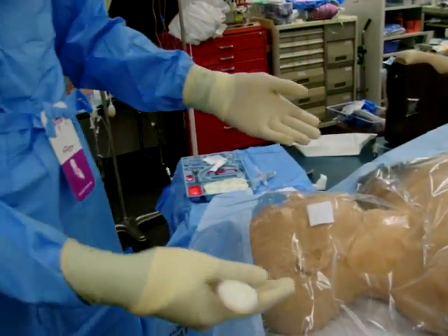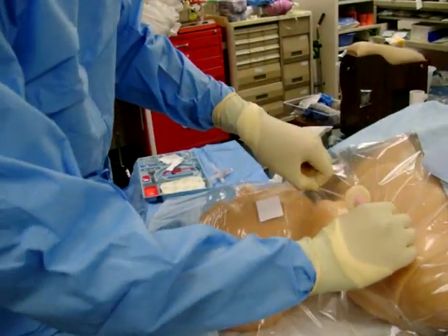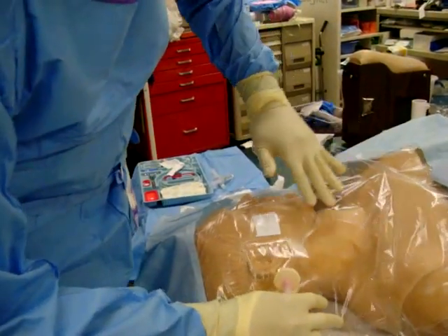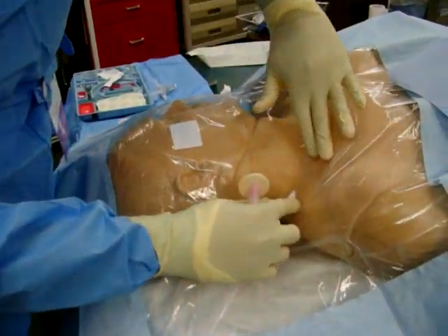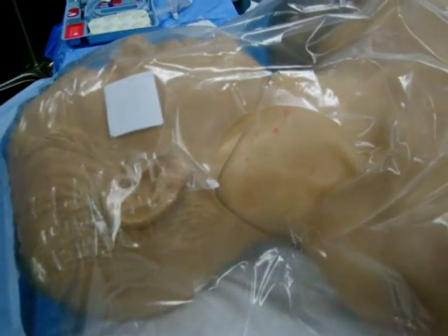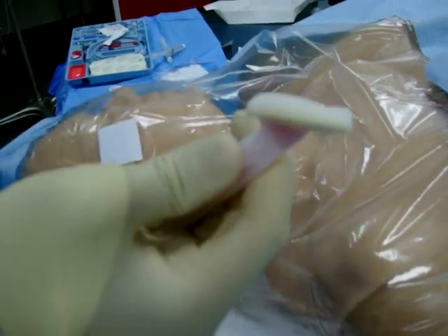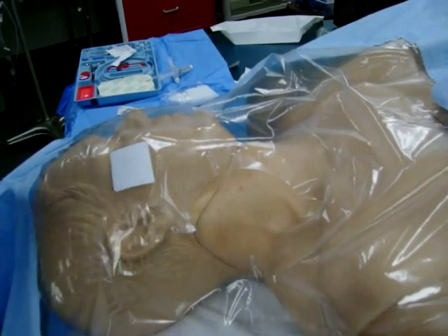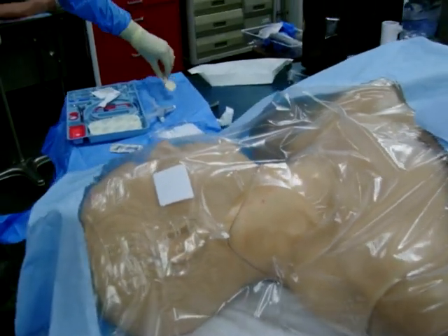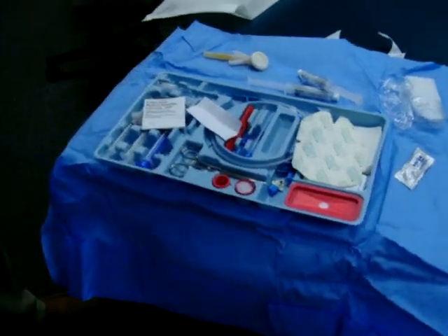Remember, if you weren't sterile when you put the drape on, you had touched underneath the side of that plastic. That's why I'll use another sterile chloroprep to get where I need to get. In this patient, right here is the appropriate placement of the circle on the drape. At this point, I would pop my chloroprep and scrub that side again to make sure I'm 100% clean. Now if we can come back over to the kit — a lot of this is preparation for the kit.